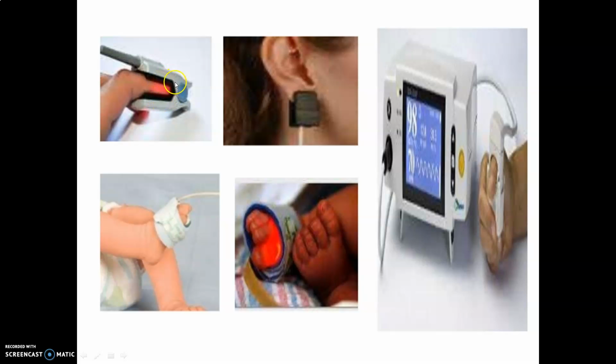Okay, so this is called your vascular bed, which has red and infrared color light, with a minimum wavelength, which we have already discussed in the previous slide. So this pulse oximeter, we are keeping it on your pinna. This is your pinna. And this is your monitor where it will show your saturation. This is your saturation level, 98. This is the pulse rate, and these are the wavelengths.